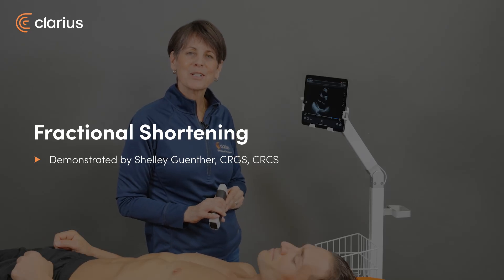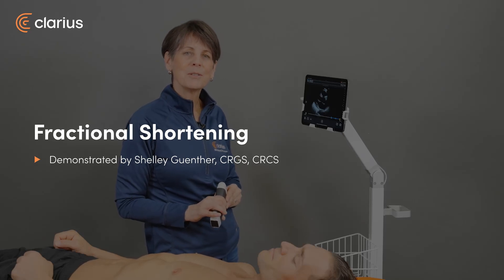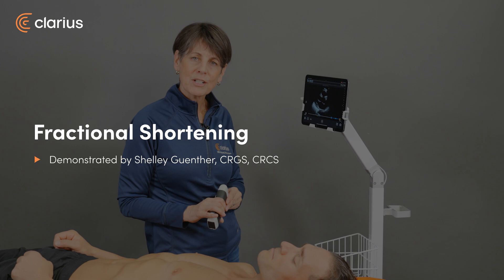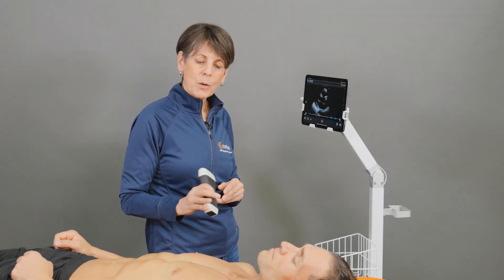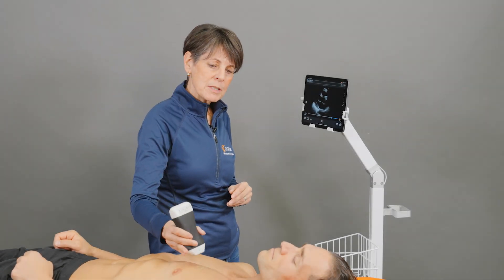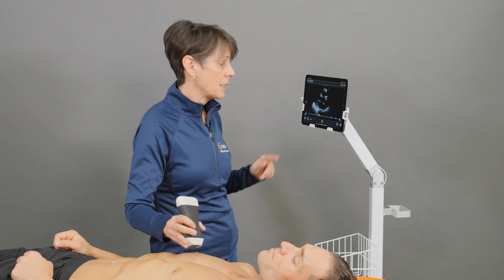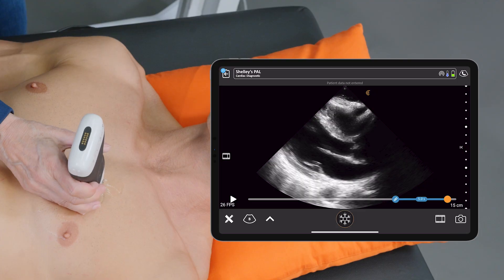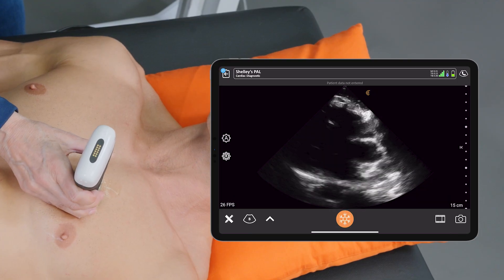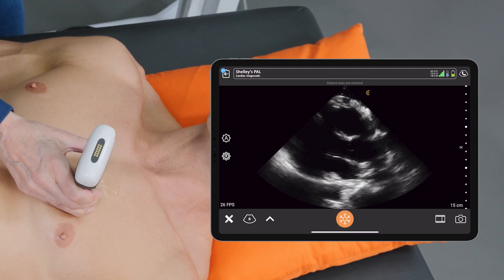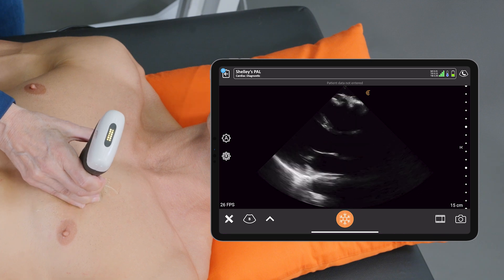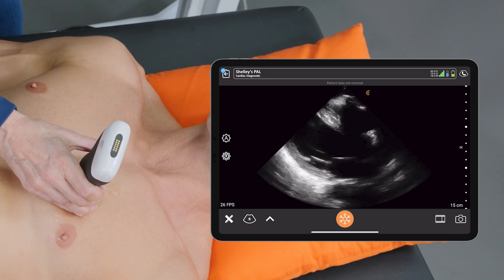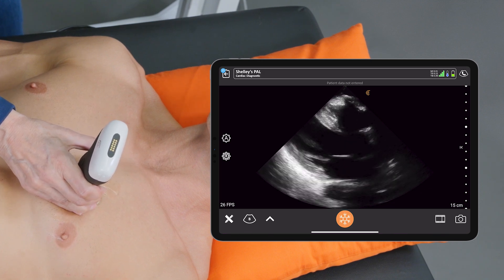Hi, my name is Shelley. Today I'm going to show you how you can get a left ventricular ejection fraction with the fractional shortening. I'm going to use the phased array scanner in the cardiac preset and I'm going to get a nice parasternal view of the left ventricle before we enter into M mode.